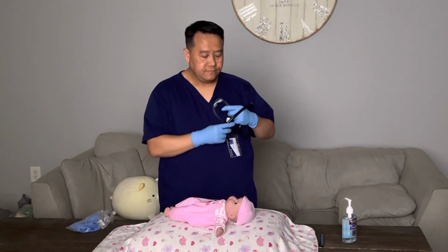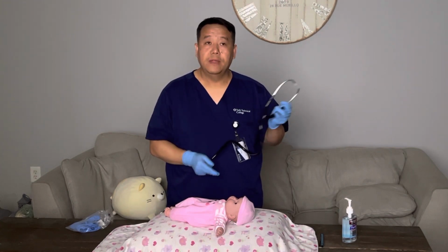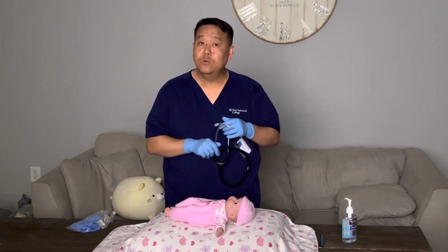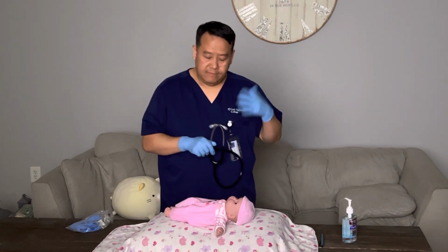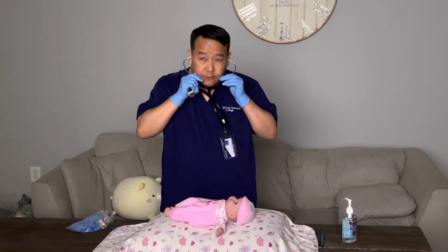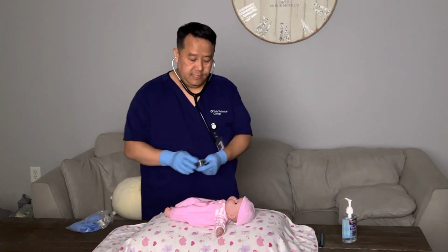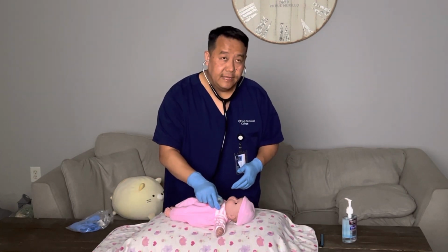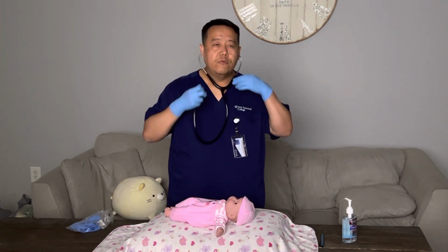And you have to listen for a minute, but for the purpose of this video, I'm not gonna do that. Normal heart rate is going to be anywhere from 120 to 160. Regular baby heart rate. Also, I would go right over the apex and listen to it. And it looks like baby Phoebe's heart rate is 135, which is right at the normal range.